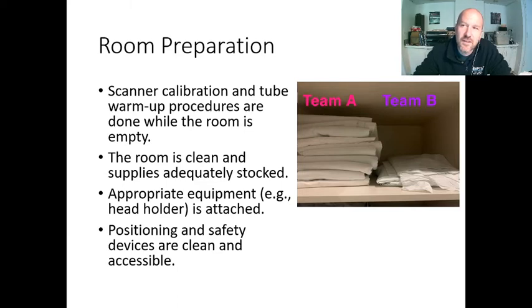Also, in addition to that, the CT scanner is going to work better if the room is clean. If the room gets dirty, it can literally throw off all sorts of calculations within the CT scanner. Just like if you dropped your cell phone into a mud puddle, you'd want to clean it up. Basically every single patient that you do in the CT room, you're dropping the scanner into a mud puddle. So clean it up.